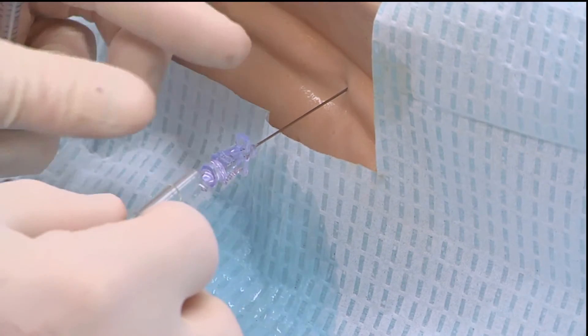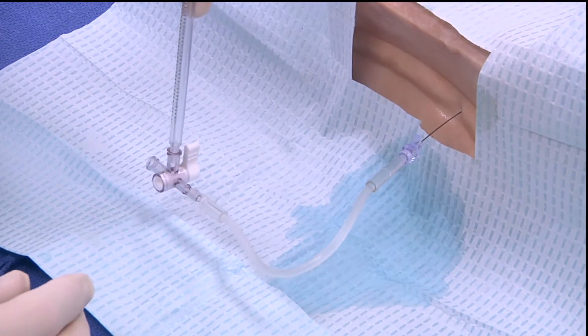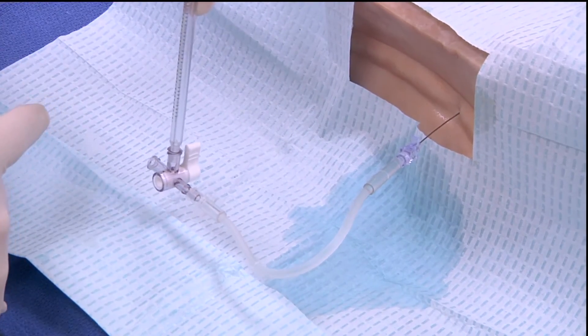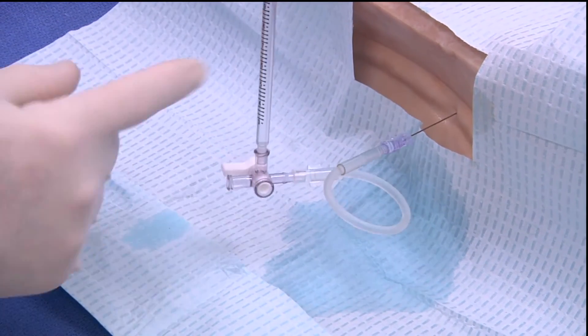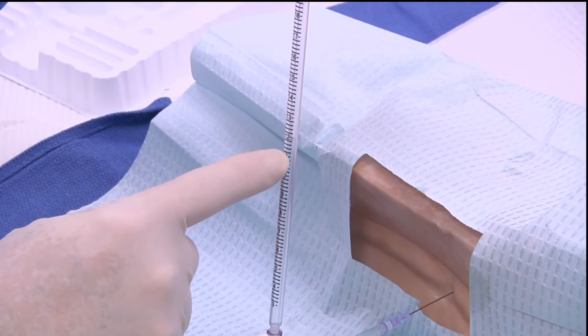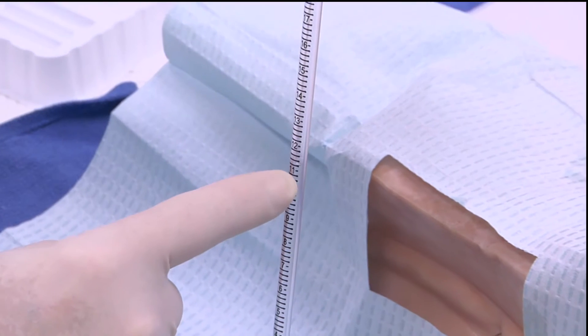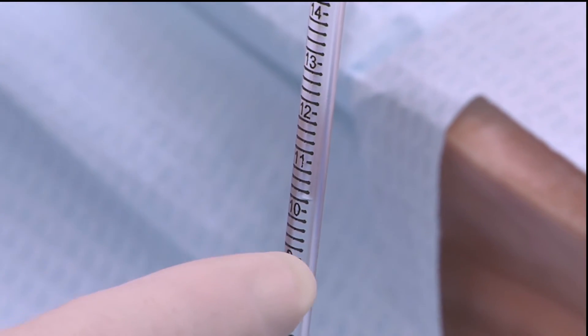Once there is egress of cerebrospinal fluid, we can hook up the manometer. We close the manometer to the outside world — that is to air pressure — and open the manometer up to the patient. You will see the rising of the cerebrospinal fluid in the manometer, and this gives us the opening pressure once the level of cerebrospinal fluid stabilizes. In this case, it's reading about 11 centimeters of water, down to about 9 and a half.